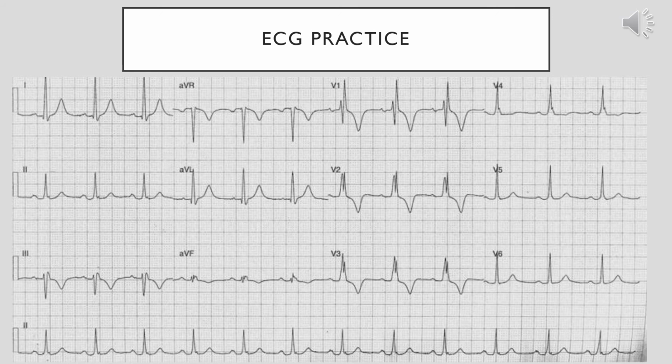Okay, some things that we want to look at as we're looking through these leads. We see a positive amplitude on leads 1, 2, and AVL. AVF looks a little negative, but it looks like we have a normal axis, so that's good. The PR interval appears to be less than 1 big block, so we're good there. The QRS complexes all look pretty tight, so that looks good.